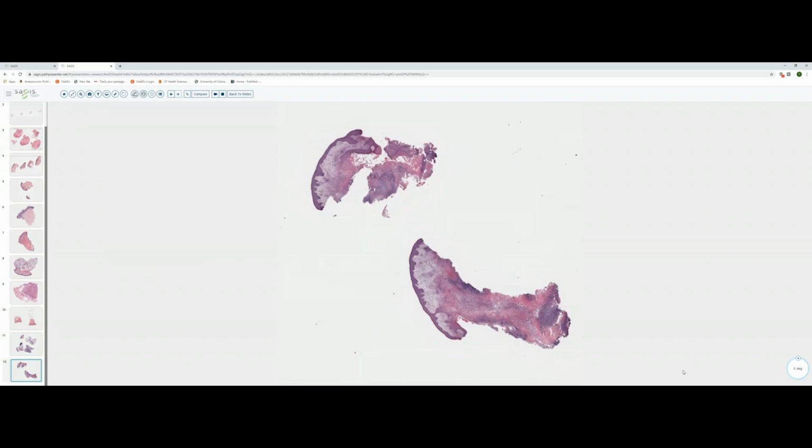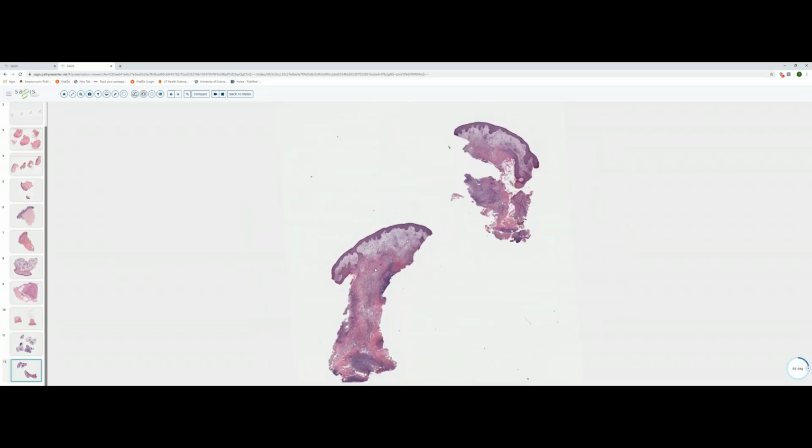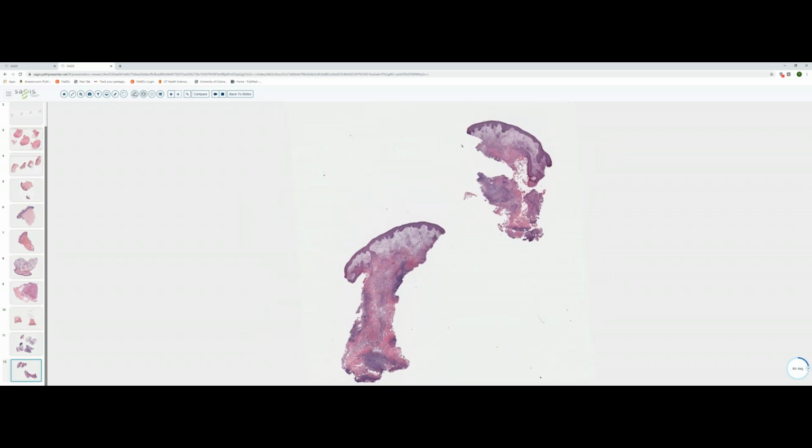And we'll go ahead and close out here with slide number 12. Slide number 12 was a horse of a different color. And one can see a very deep punch biopsy. Obviously, there are nodular accumulations of inflammatory cells here in the dermis. Very pink and acellular centrally, which usually indicates that there's quite a bit of degeneration of collagen and necrosis. Almost looks, in the top piece, like there's a follicle that's ruptured or some type of squamous lined channel.